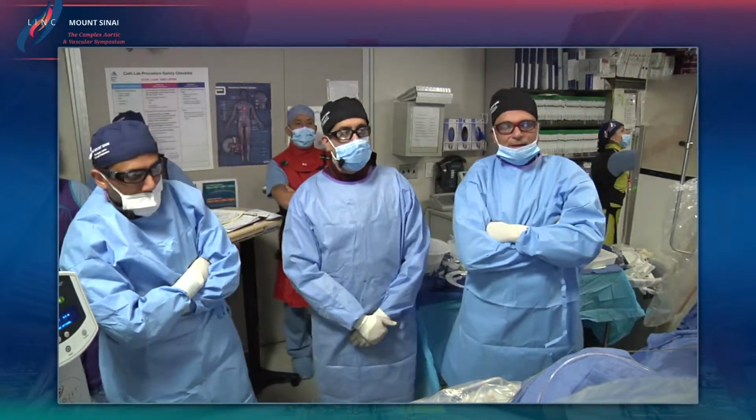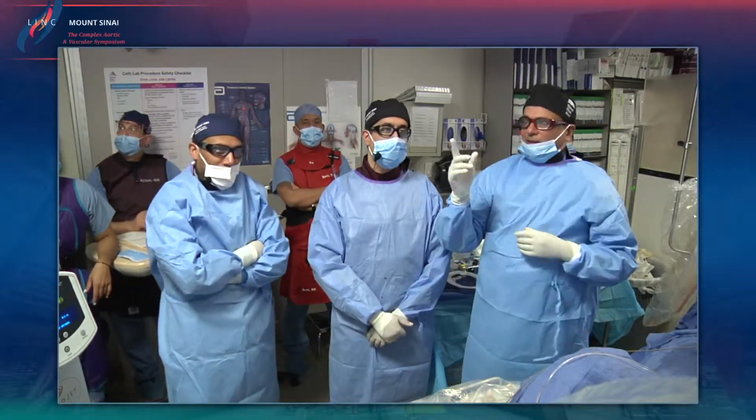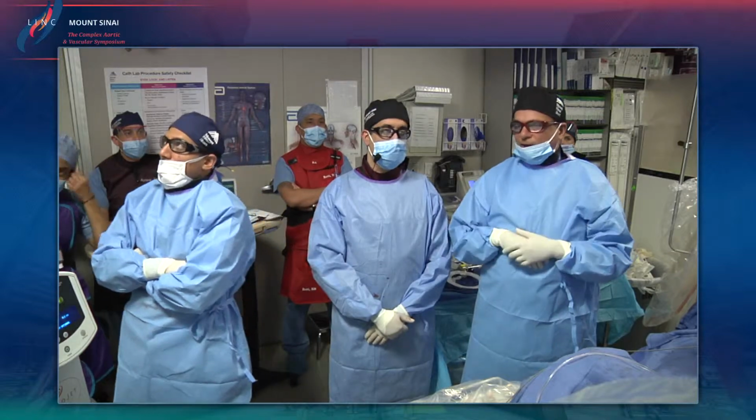Can you show us the final results or a new case? No, we actually have moved on to a new case now. Okay, great. So you saw the final result on that one. All we did was put a short self-expanding stent, the way Chris said, and we'll show you the final result later. It's not an issue at all.